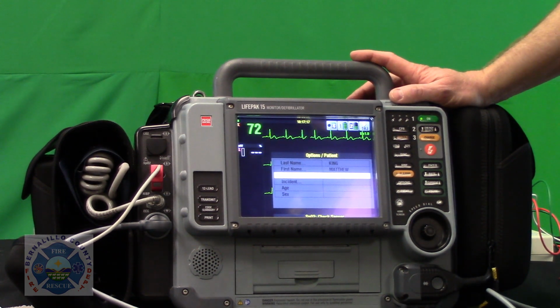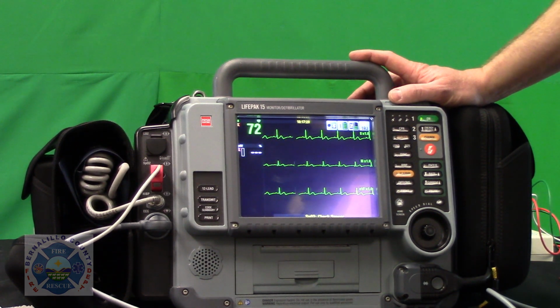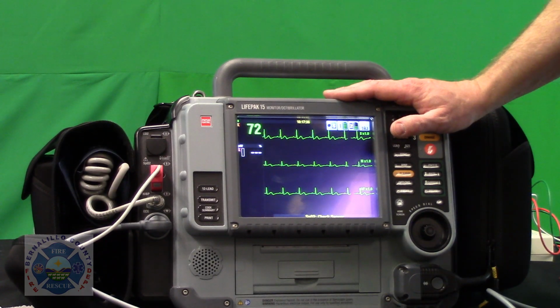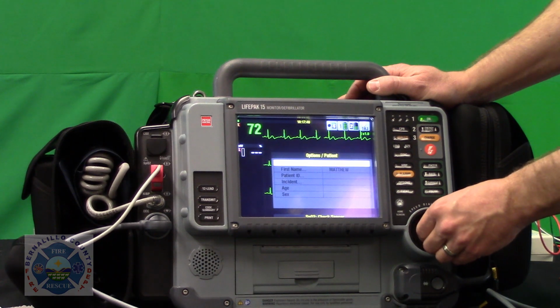What we see a lot in our system is we see a lot of seniors and juniors. So if my father's Matthew King Sr. and I'm Matthew King Jr., and we've both been going to Presbyterian or UNMH our entire lives, our medical record, it's going to be difficult for them to figure out if I'm senior or junior if the next step is to look at my birth date. So make sure you're doing the correct patient's given name.